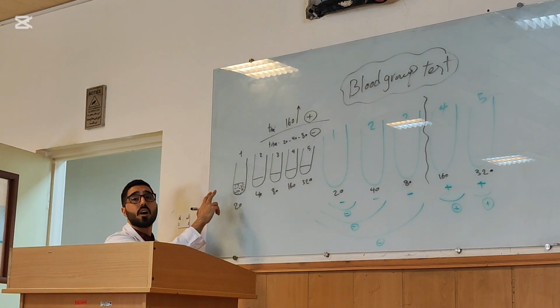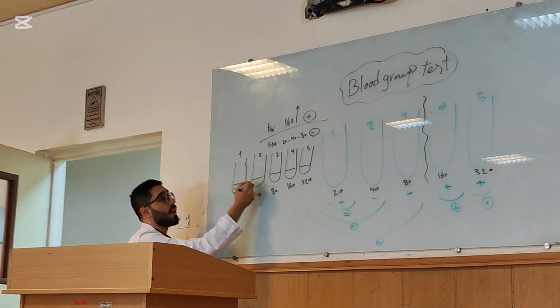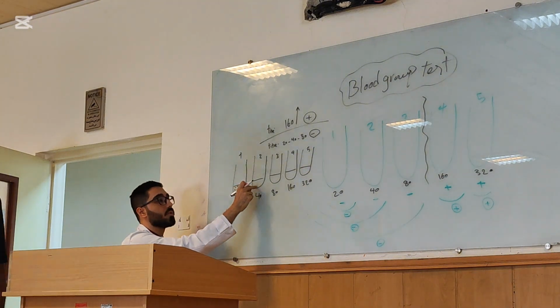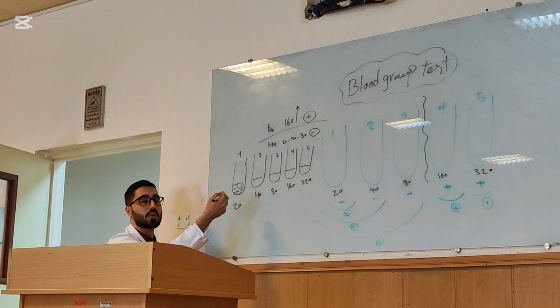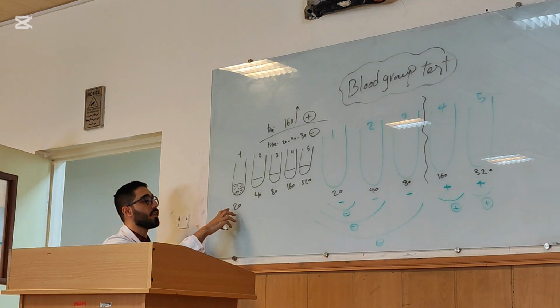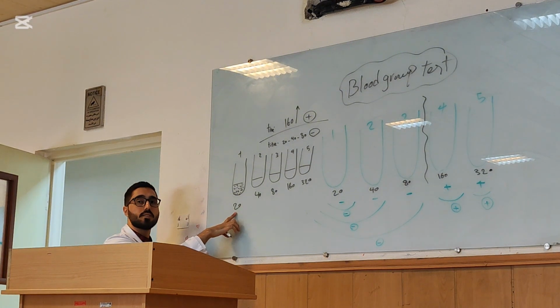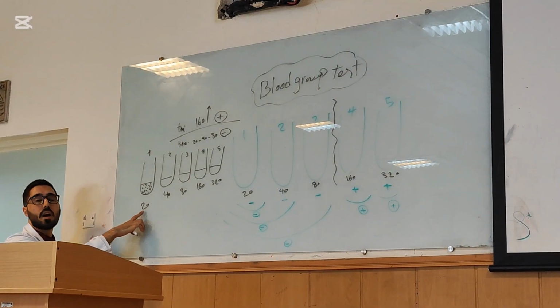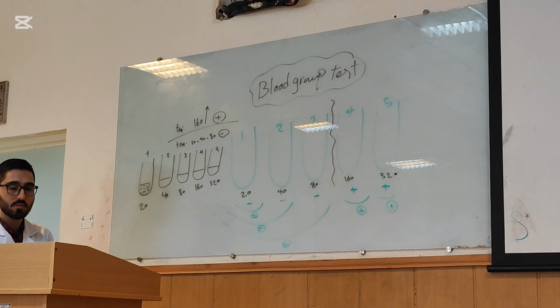We don't have any agglutination in the other tubes, but we have a cloudy white solution, without any agglutination. You must see agglutination in only 1 tube. My titer of the test is 20, and because of that the test is negative, and my person is healthy. Okay? Any question?